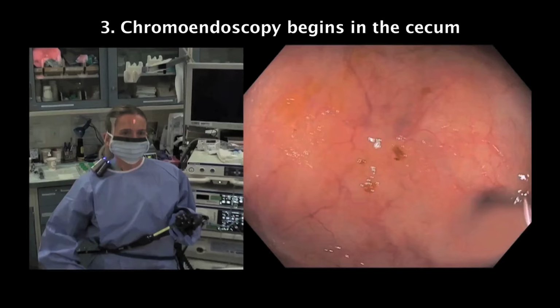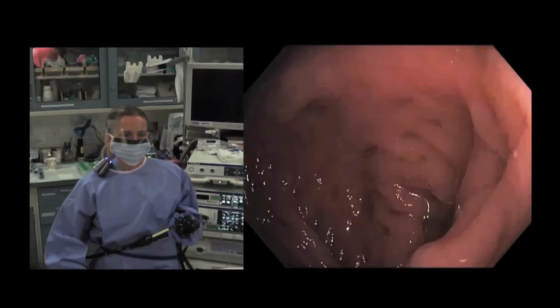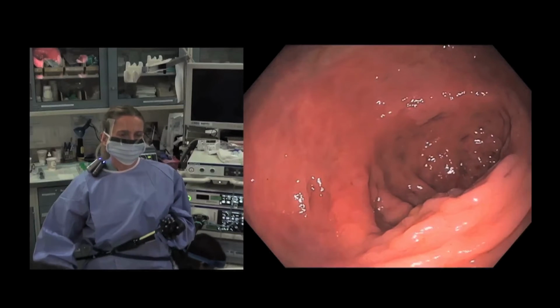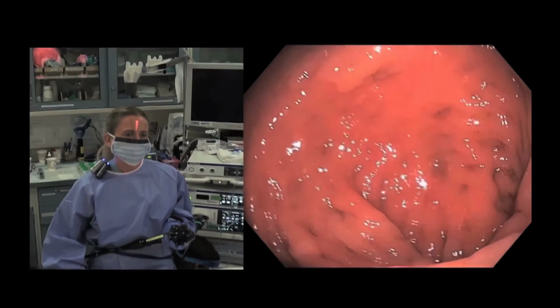We will now demonstrate the proper technique. So we're going to now change to indigo carmine diluted through the foot pedal. We use 2 ampules of indigo carmine and 250 cc's of water.